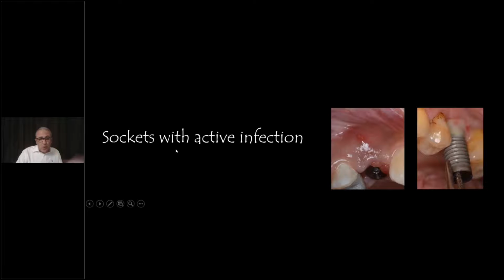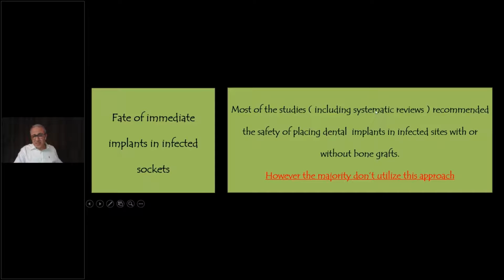And when we go even further with socket infection, when you have an infected socket like this, what would you do with an infected socket like this? Most of the studies that I have searched in the literature so many times, I found a lot of systematic reviews that recommended, all of them said it's no problem when you take teeth out, when you have infection, clean well, don't put bone grafts, put implants with or without bone grafts either, and you feel comfortable. All of the results were really okay. And I have seen this in all the literature.